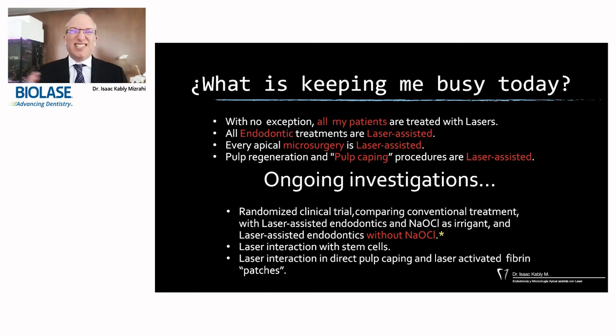Laser interactions with stem cells. I have some research on it too, and how the lasers can interact in direct pulp capping with some fibrin patches. I take some blood in the centrifuge, and then I apply some laser before I put it in, and how it can be beneficial for our patients if we do so.